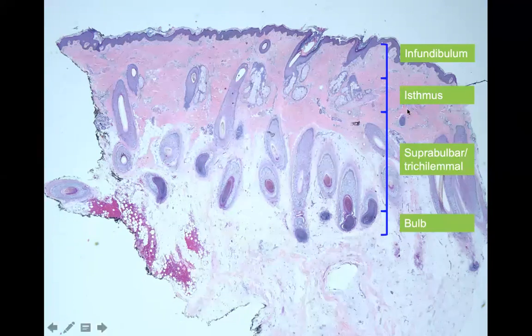So as a review, we kind of covered this in the normal skin section, but let's look at a biopsy of the scalp. So these are terminal hairs. Terminal hairs should be down to the fat. You see the matrical portion of these follicles are down in the fat. And these are cut slightly slanted, but then you can see them go up and open into the epidermis.